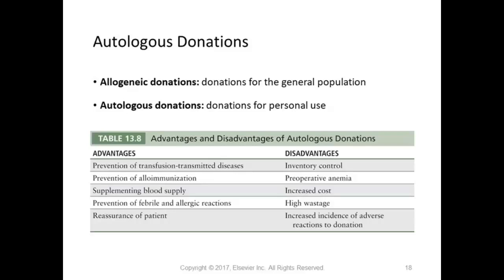The patient's autologous donor crit has to be no lower than, H&H can be no lower than 11 and 33. Blood collection should be completed more than 72 hours before surgery, and there's no age restriction. So the autologous unit is collected. The A, B, O, and D type is determined at Vitalant. Autologous units, if not used, cannot be used.